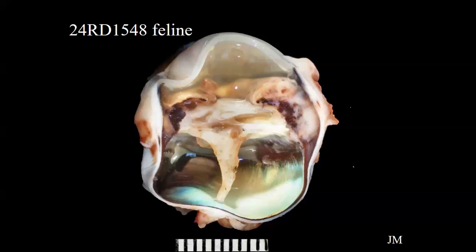Grossly, what we have here, again, cornea up at the top. Here is one iris leaflet, and you can see sort of into the back here how thick this iris leaflet is and how white it is. The lens should be here, but we don't really make out much lens fibers, so looking for potentially leftover lens capsule here where it should be. Retina here is detached, forming this nice little tornado as well.